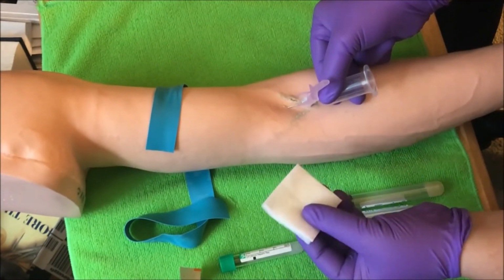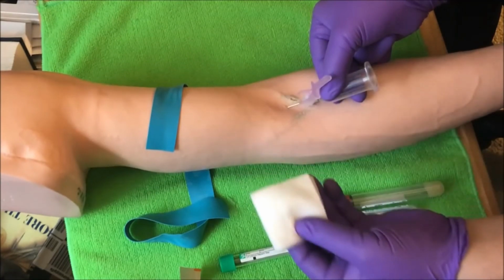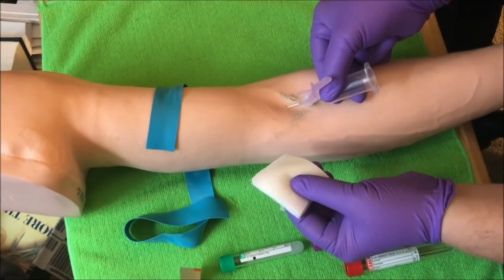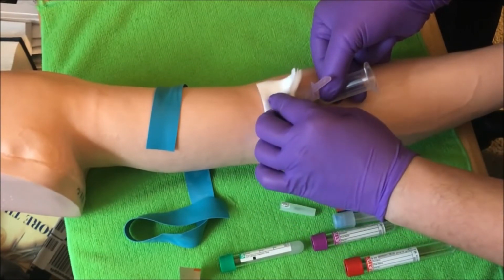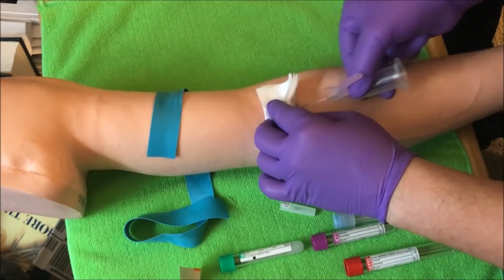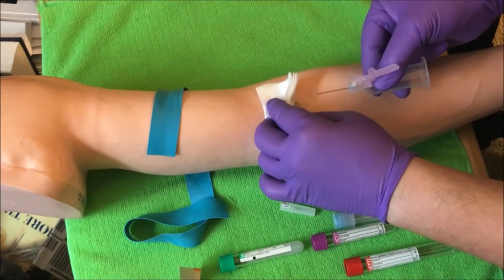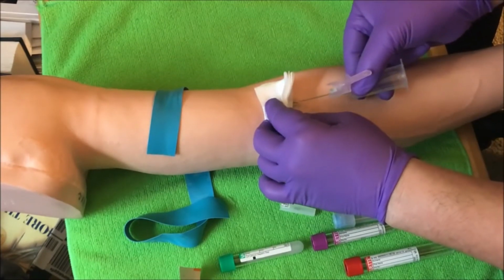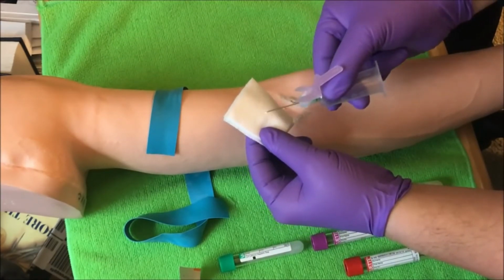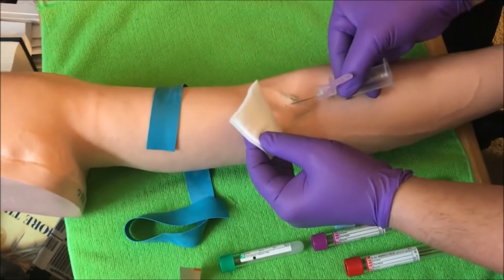What I like to do, I never like to put my 2x2 over the needle, okay? I keep it on the side. The reason being is, again, safety. If I put my hand over the needle and just place it here, when I come out, if the patient should jerk or I get bumped, where is the needle? It's lined up right here in front of my hand and finger. And this needle can go right through the gauze and stick me with a contaminated needle with blood on it. So I don't want to do that.